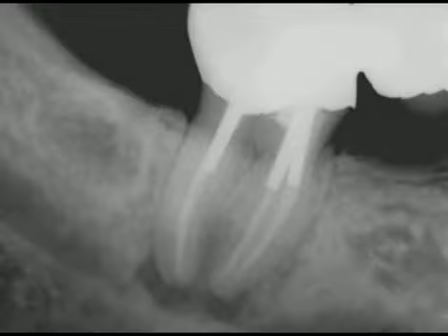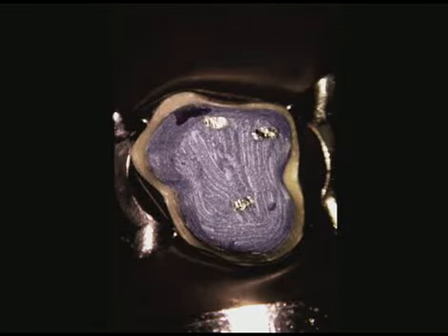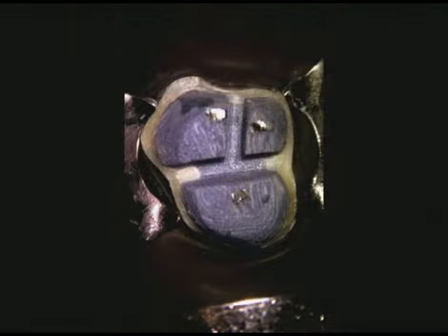This preoperative radiograph of a mandibular right second molar bridge abutment demonstrates 3 posts, previous endodontics, and apical pathology. Following coronal disassembly, the isolated tooth reveals the core, the heads of 3 posts, and a marked protuberance toward the mesiolingual aspect of the crown.